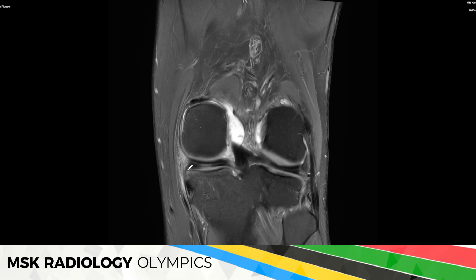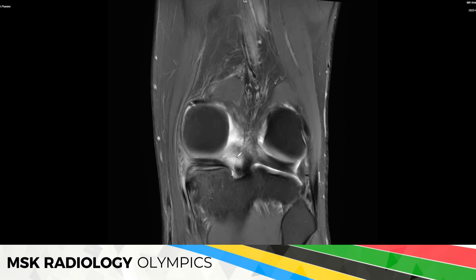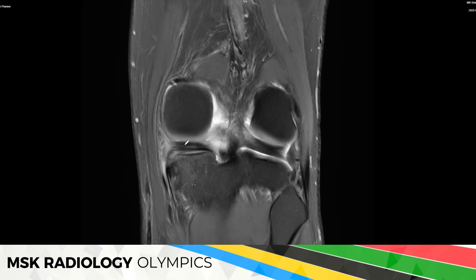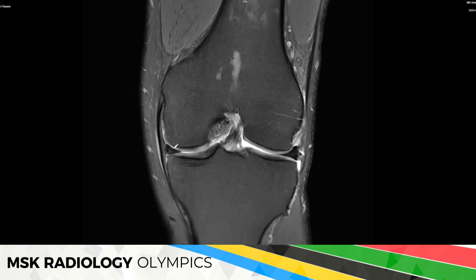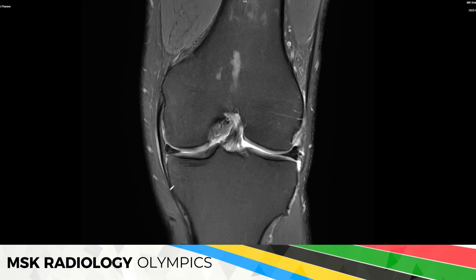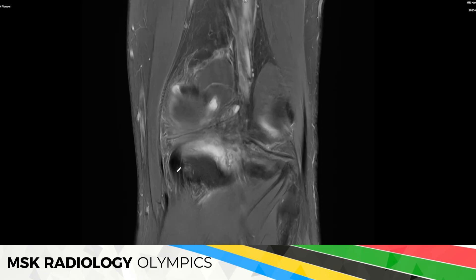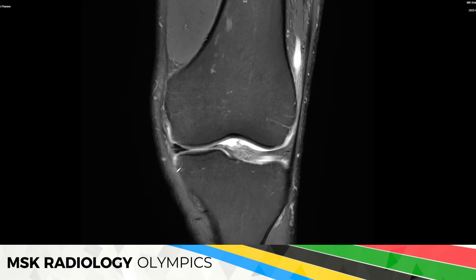In terms of cartilage, things look quite okay. There is some mild bone marrow edema and some irritation of the meniscal-capsular junction or the attachment of the capsule and meniscal-capsular ligaments. There's also a little bit of edema along the MCL, which is just irritation of these structures from the complex meniscal tear.